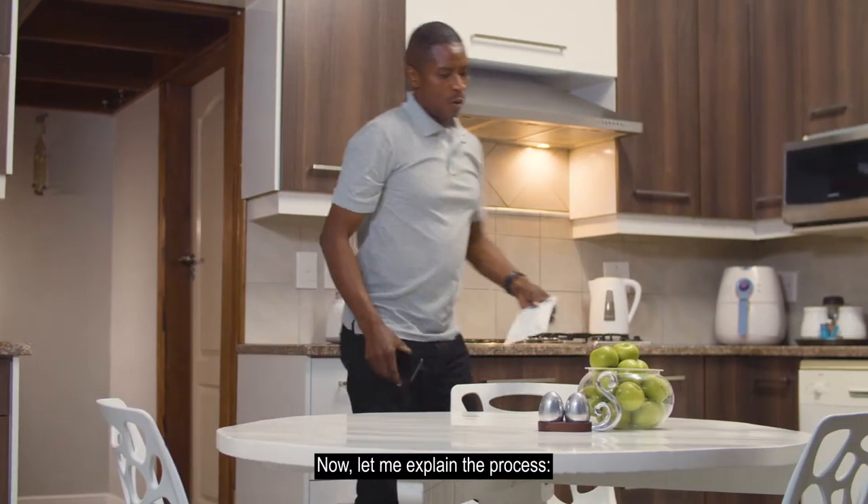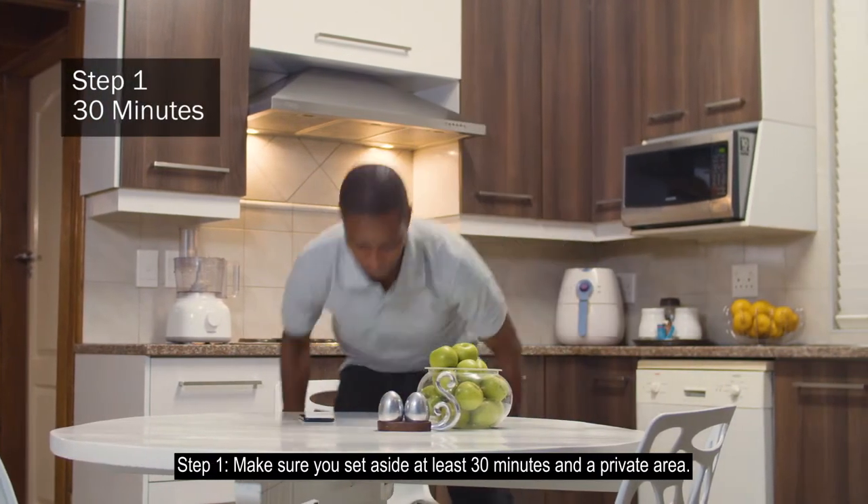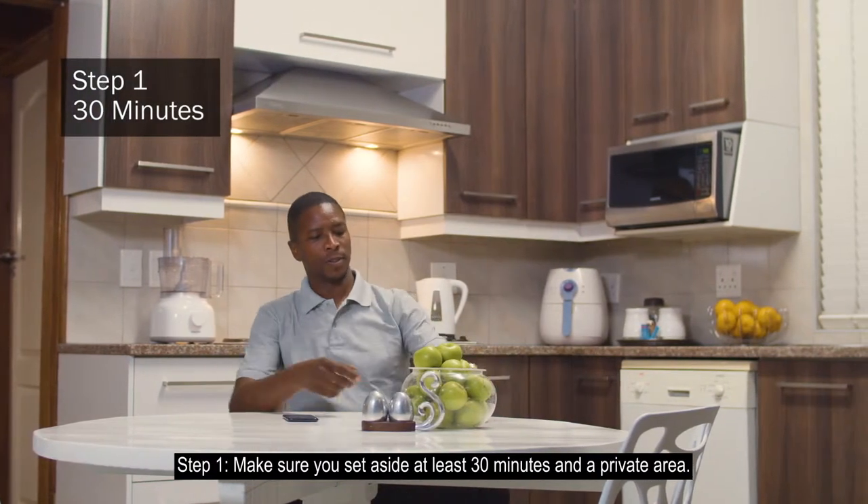Now, let me explain the process. Step 1: Make sure you set aside at least 30 minutes in a private area.